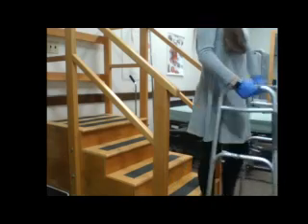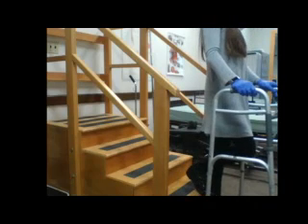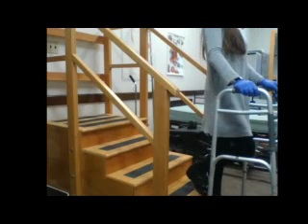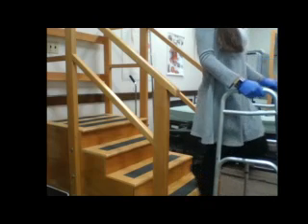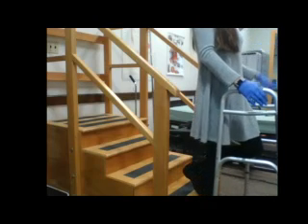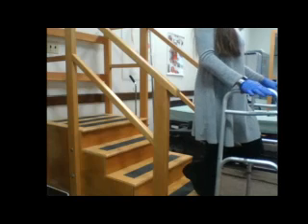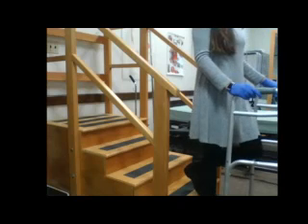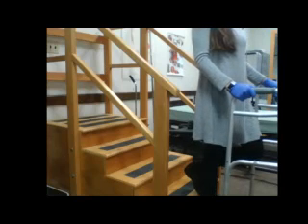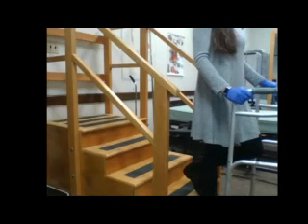What I always recommend with my patients who use walkers and have stairs is to have a walker for the bottom of the stairs and a walker at the top of the stairs, so they leave one on each floor. Now, insurance companies will only pay for one walker every so many years. However, there are a lot of resources in every community in order to be able to get somebody another walker for inexpensive. So for example, you can usually pick them up at thrift stores for a couple dollars a piece.